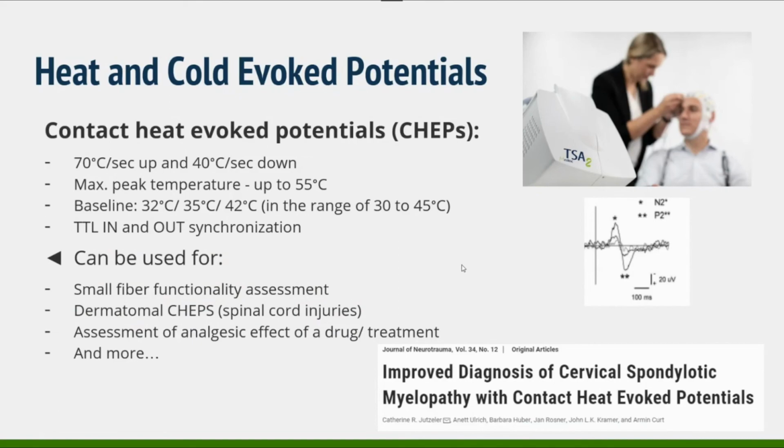Because in addition to just showing you the functional information, it can also show the recovery after treatment, for example. So if you do a surgery or some other treatment for spinal cord injury, you can really show the course of improvement, not only anatomically, but also functionally.